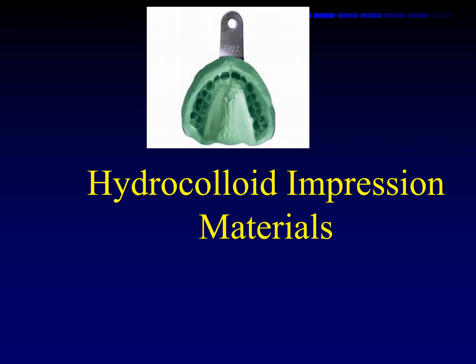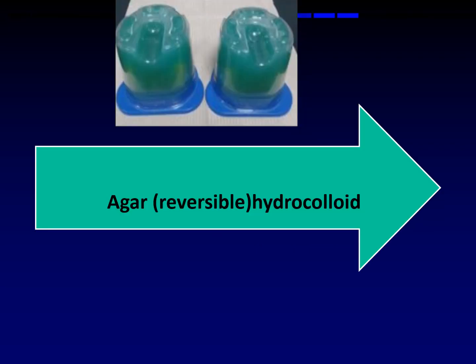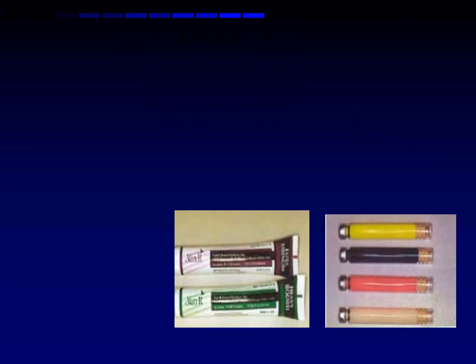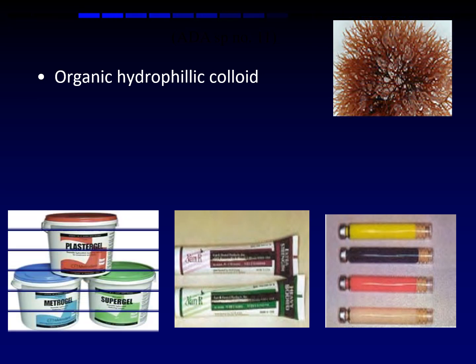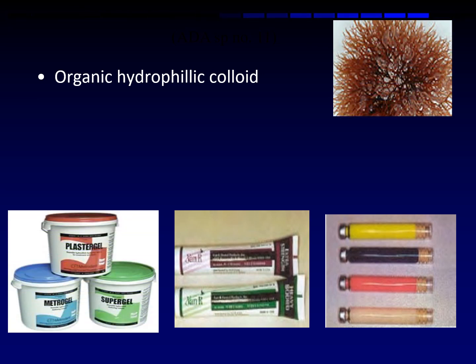Good morning. This lecture is on hydrocolloid impression material: recent advances. Let's start with agar. It is a reversible hydrocolloid impression material. It is hydrophilic in nature. It is available in bucket form, paste form, and cartridge form.